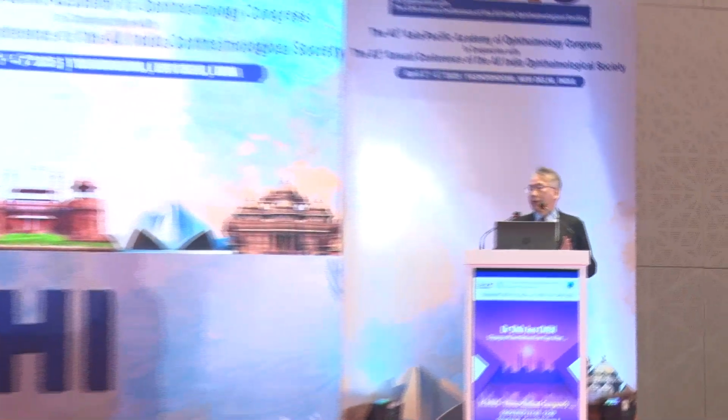What intraocular tamponading agent would you decide for your GRT cases? Not the complicated ones. Which is your preferred intraocular tamponading agent? I'm sorry, you mean which kind, gas or silicone oil, at the end of the surgery? Which would you like to use and why? Like I said, if you happen to have a slippage, then probably you can shift to silicone oil to decrease the compression of the fold.